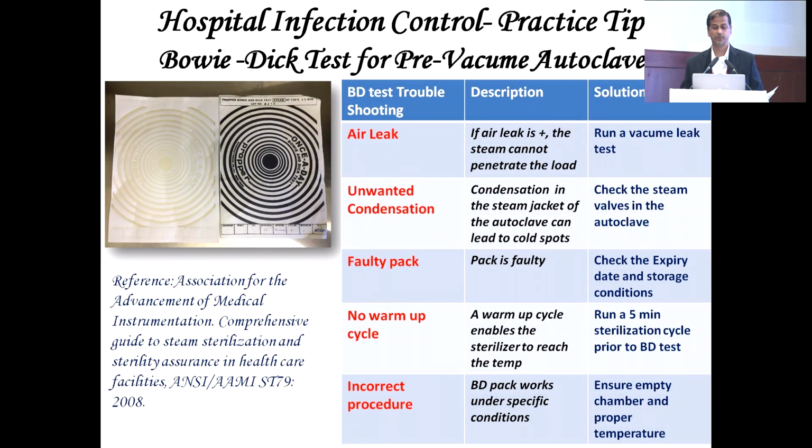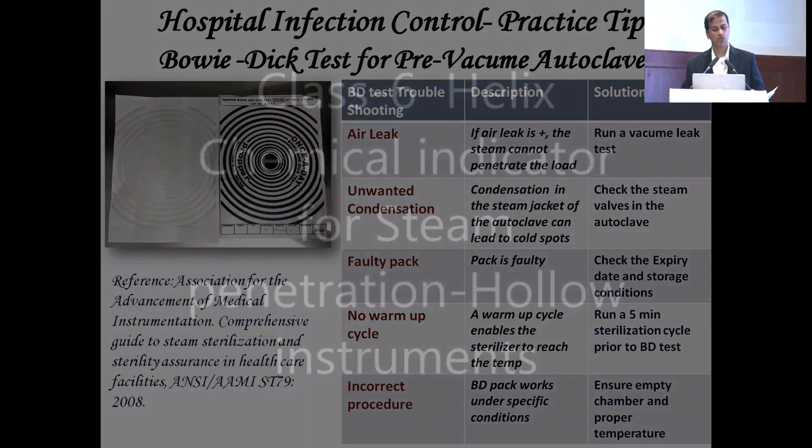This is the troubleshooting of a Bowie-Dick test, which I already discussed. When you have an air leak, unwanted condensation, or a faulty pack, the Bowie-Dick test fails. So these things have to be kept in mind, and if you have a faulty Bowie-Dick test, look into it.